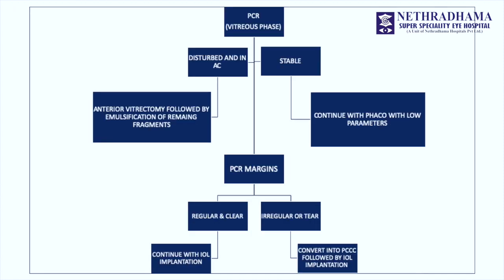When you have a PCR, if it is a punched-out kind with clear margins, then you have to very carefully put in viscoelastic before withdrawing your probe and remove your fragments if there is no vitreous. If there is vitreous in the anterior chamber, it is better to deal with the vitreous and do an anterior vitrectomy before attempting to remove the fragments. If the PCR is irregular and there is a tear, it is better to convert it into a PCCC with strong margins so that it does not run off.